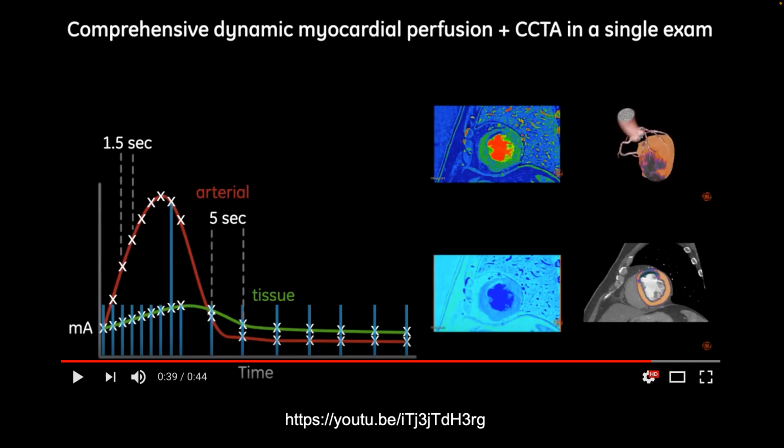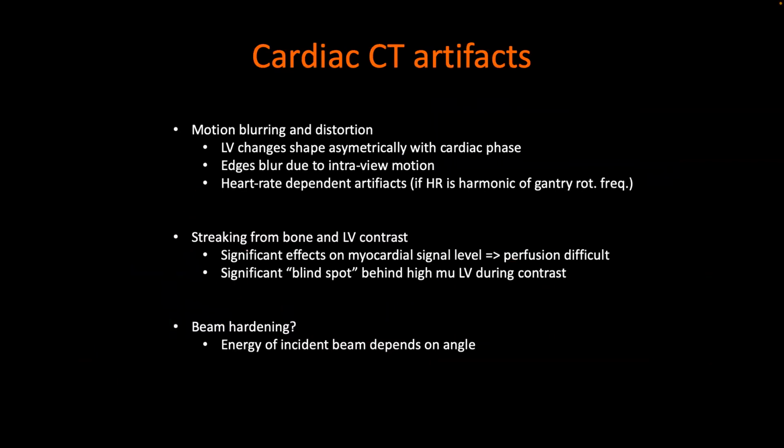This has been studied extensively by a few groups with modern CT technology, and we've done it a lot. My conclusion is that it's really hard to do, right? So this works a certain percentage of the time. A certain percentage of the time, it just doesn't work very well. And I can't give you an explanation of why, right? There's a number of factors involved, but it's not a simple reason why it doesn't work all the time.